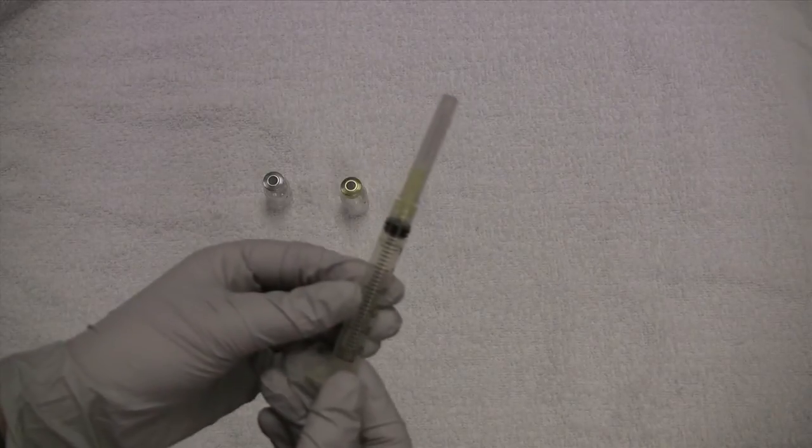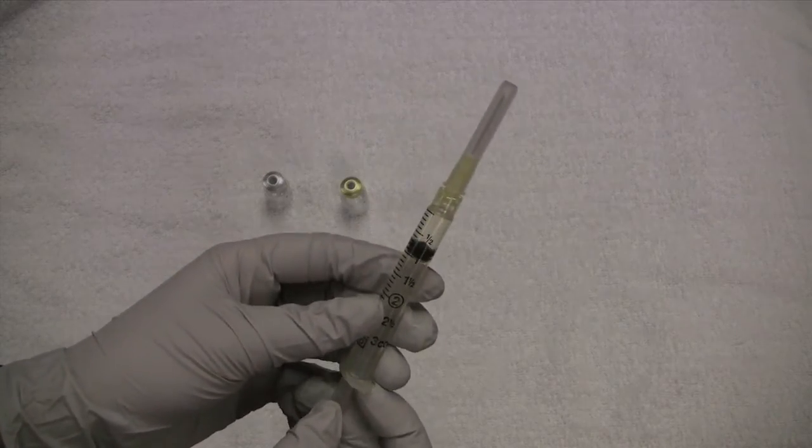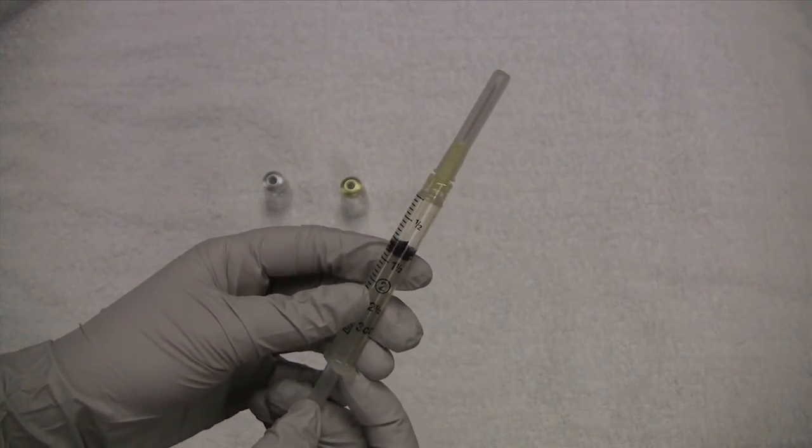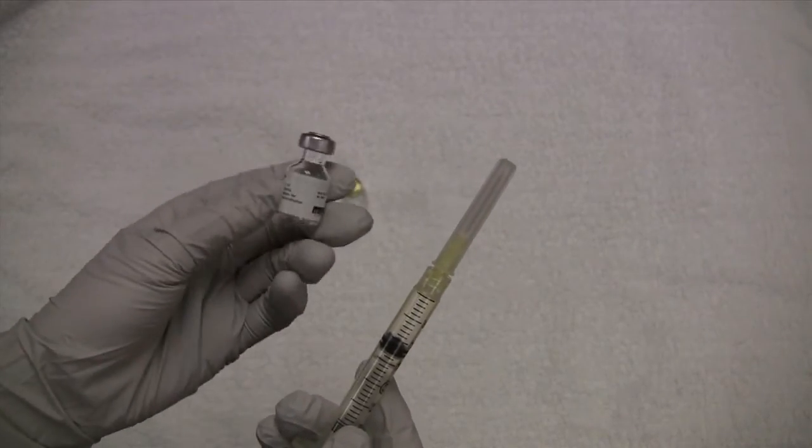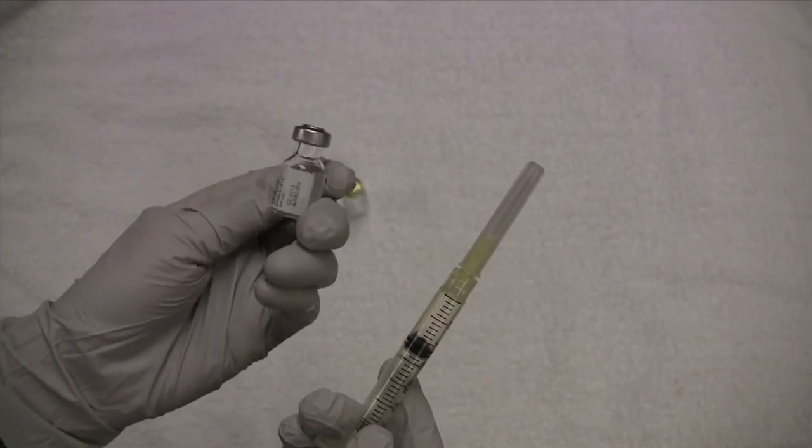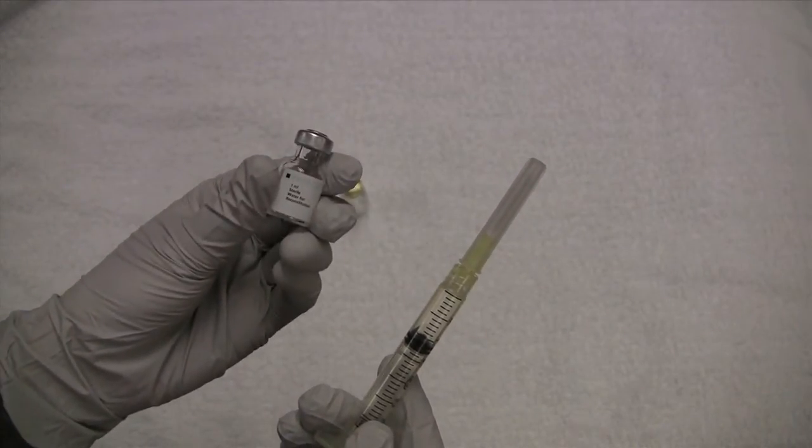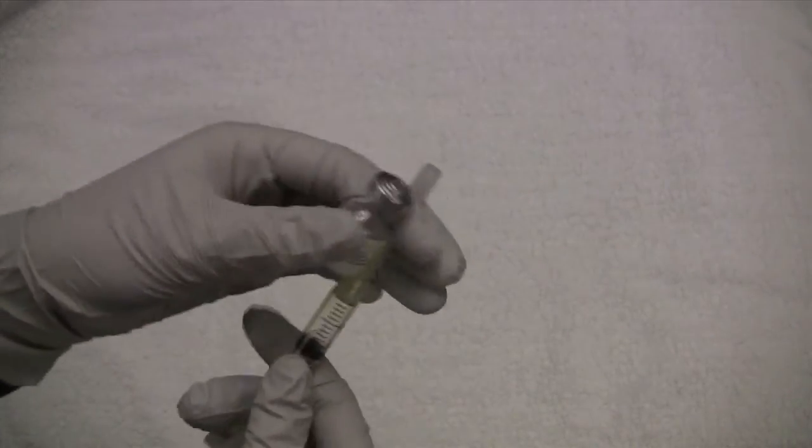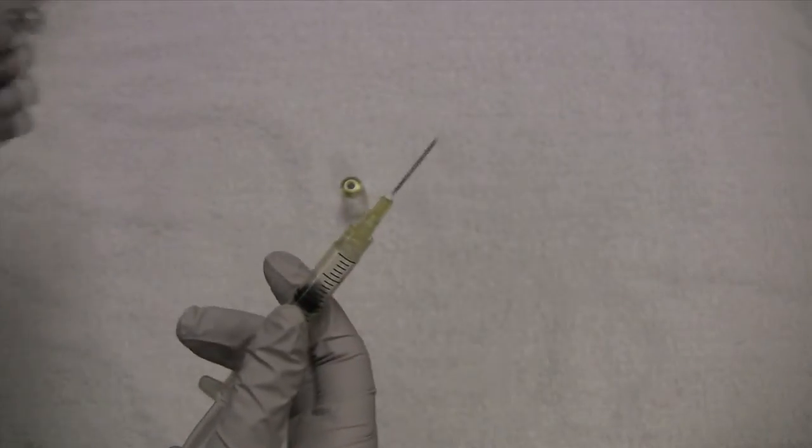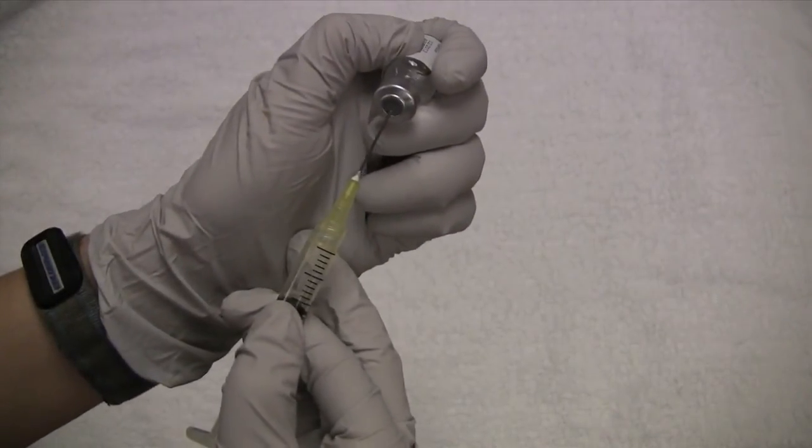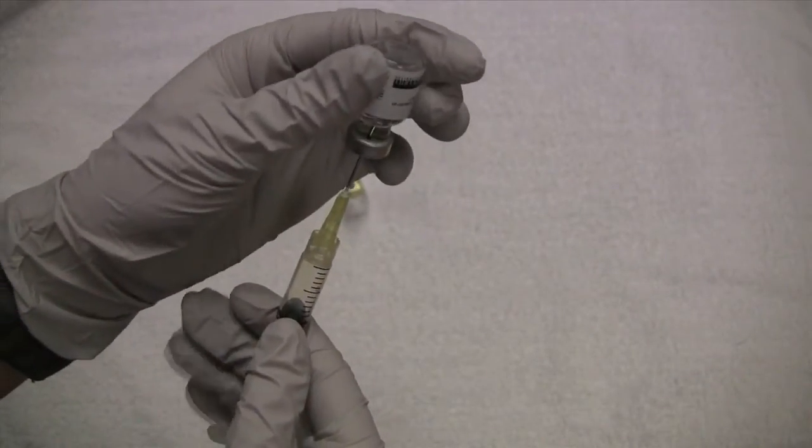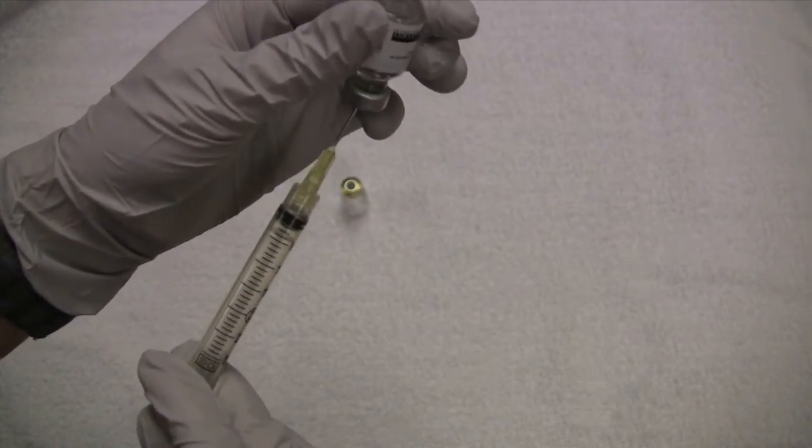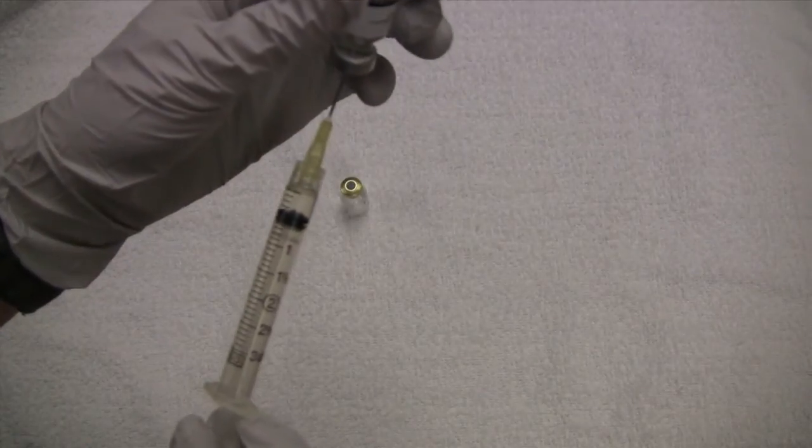Next I have my 3 mL syringe already put together. I'm going to pull back and draw in 1 mL of air. And I want to inject air into the vial of water, which allows for easier retrieval of the sterile water. Air goes in, water comes out.